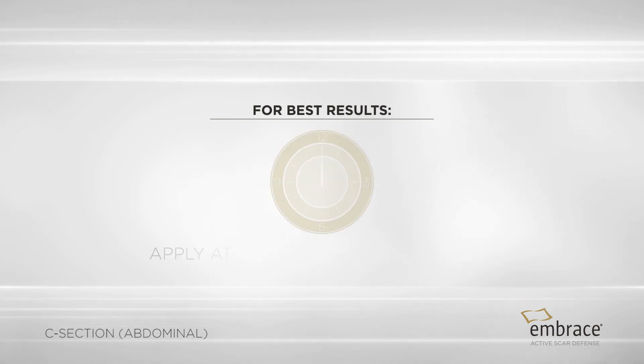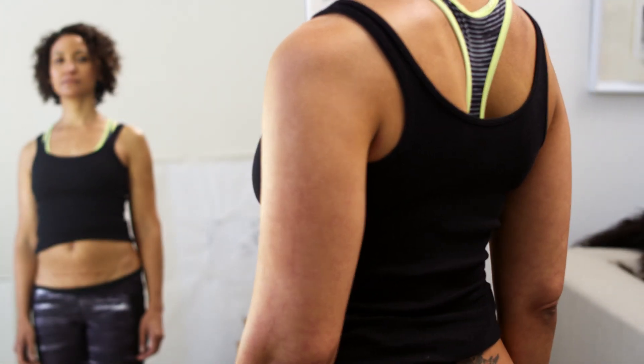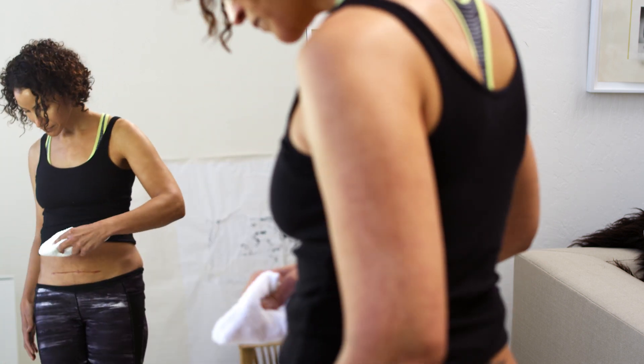For best results, we recommend applying at night at least two hours before bed. Use a mirror for guidance and avoid bending to look at your scar while applying Embrace. Bending over to check the dressing during application could add excess tension and make wearing Embrace uncomfortable.